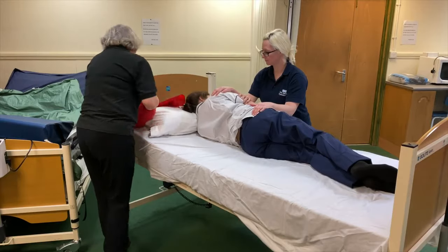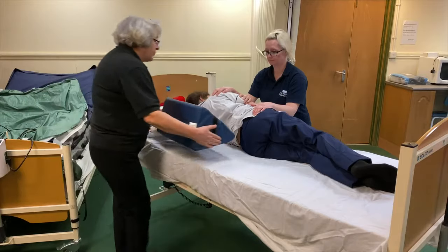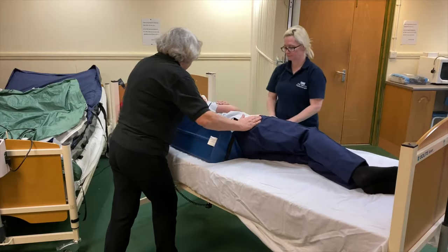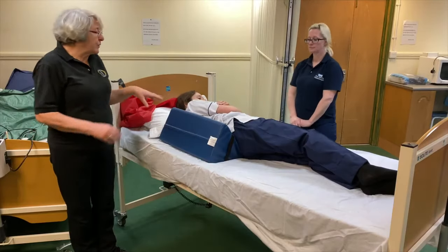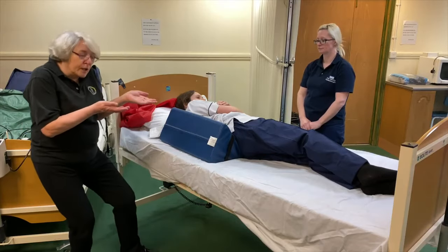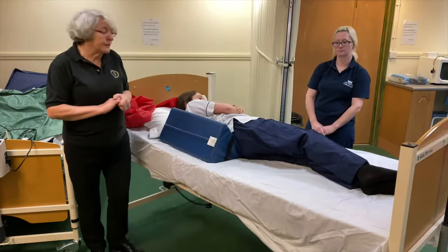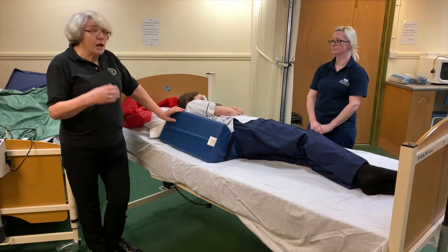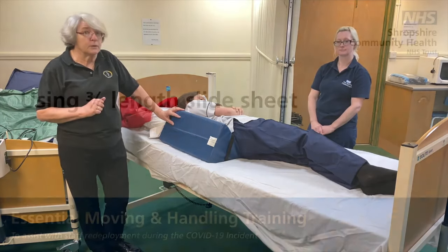Right, that is 90 degrees, but we don't want that. So the community hospitals now have the positioning wedge. We put this into place, and then she can be gently laid back on it, and that is now 30-degree tilt. She can now be left. We comfort her. If we need to take her shoulder out, Lisa can do a lovely little movement with her shoulder. If we need pillows, then we position her into that. Is everybody happy with that? So she's side lying until the next time we move her according to the turning chart.